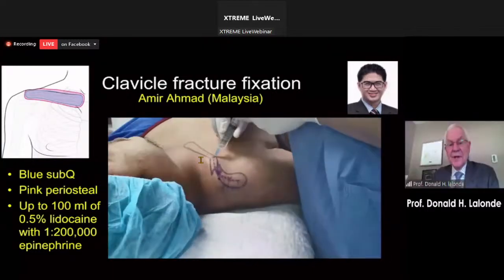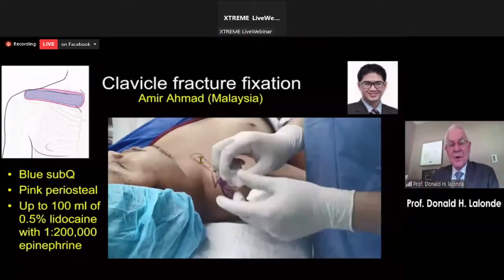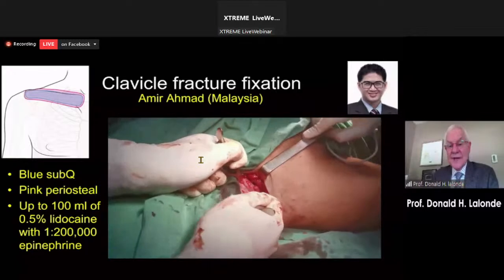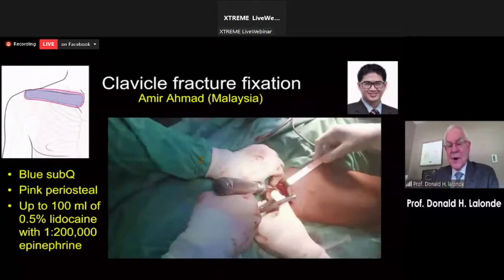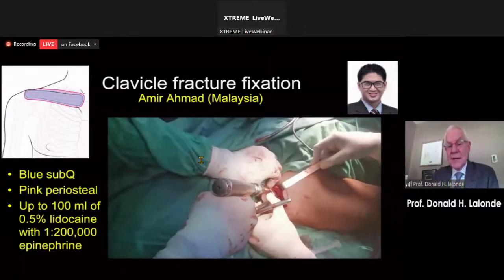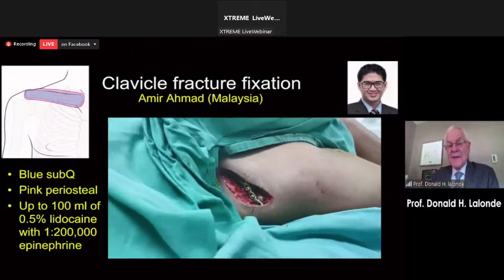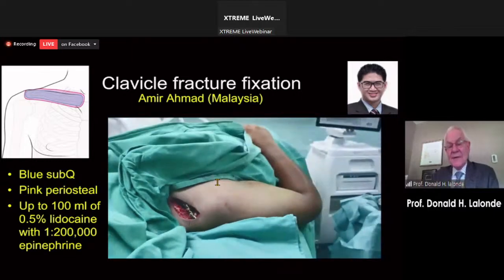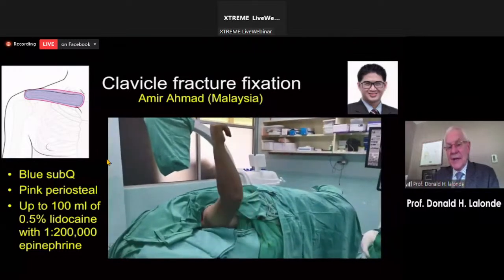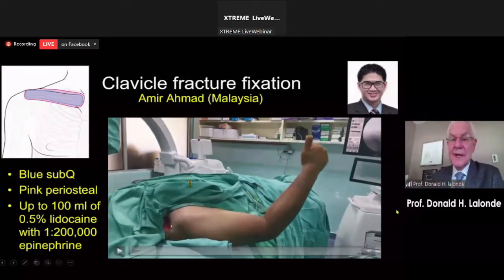And whether you're doing a clavicle, an ankle, a distal radius, an elbow, or any of those bones, you always have to bathe the entire periosteum beyond wherever you're going to put a screw. So you need to get the distal end of the cortex on the other side of the screw when you're doing this work. And then he tests the stability. And for him, this has greatly decreased the cost of surgery in Malaysia, especially in people who are frail, who can't tolerate general anesthesia.